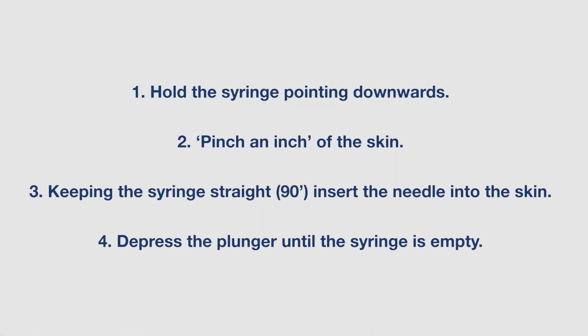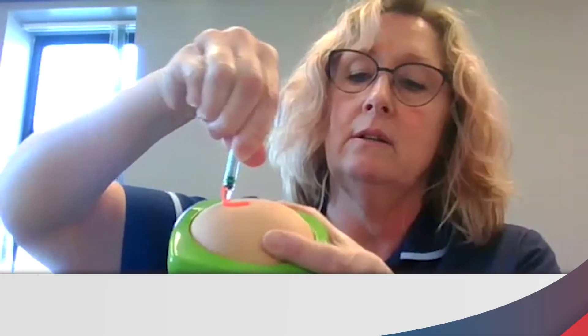Then put your finger on the plunger and plunge it down slowly, gently. Remove the needle, snap it into the needle cover to protect it, and put it straight into a sharps box. Don't rub the skin — it will sting for five to ten minutes. If you get a little tiny blob of blood or heparin when you take the needle out, just dab it with a tissue and leave well alone.